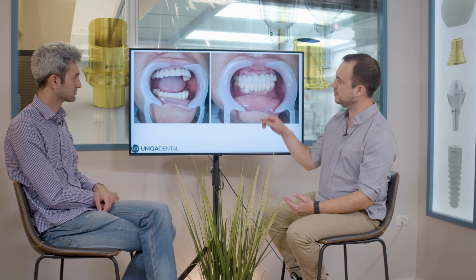You can see that this picture was taken after it took some healing process. You can see that the gingival color is somewhat better. You don't see all the blood and the inflammation that was there because of the surgery. You can see that the relations are the same as they were before. This was taken about a week or so after the operation. You can still see that there is no complete healing of the gingiva, but everything is much better.